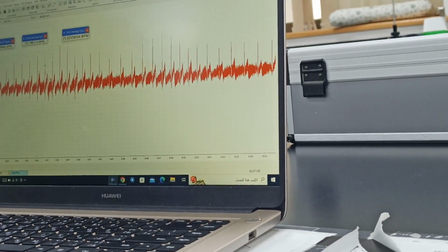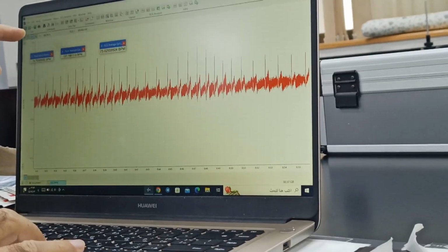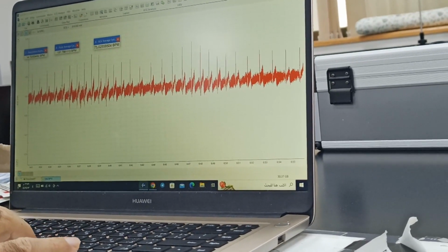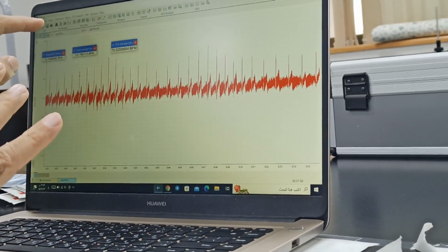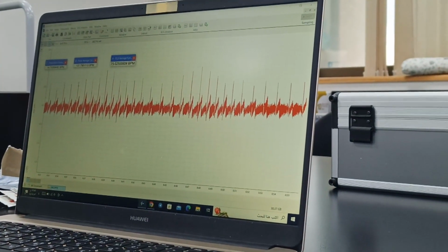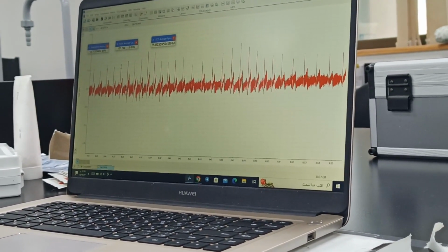This is not something you will be using later. It is just to demonstrate. So it is something around 765 milliseconds. If we go to the next one or the previous one, it is 753 milliseconds. So there's a difference, isn't it? Yes. So every beat is different. This is variability. Every two beats have a different time interval. So there is a beat to beat variation.